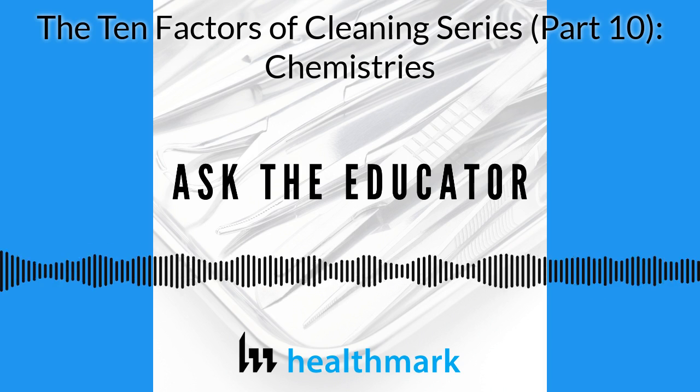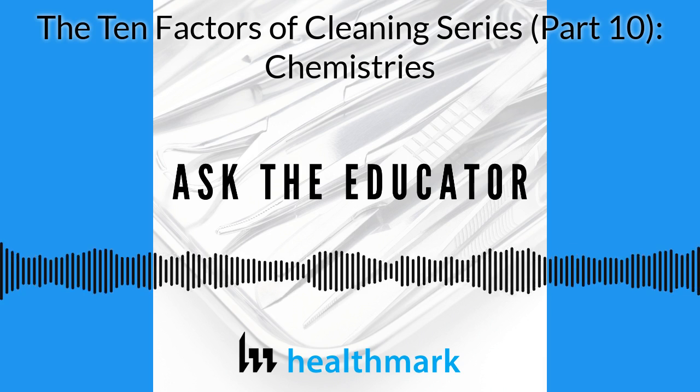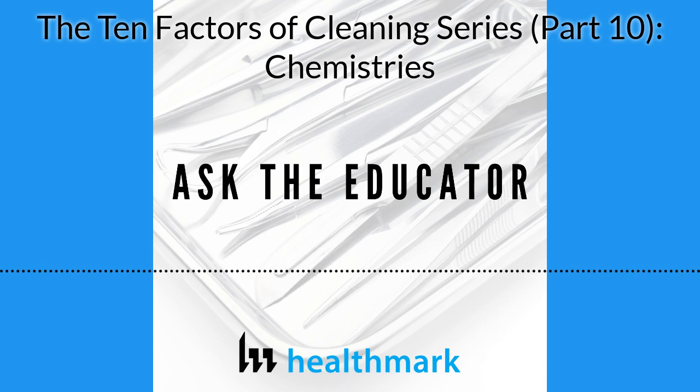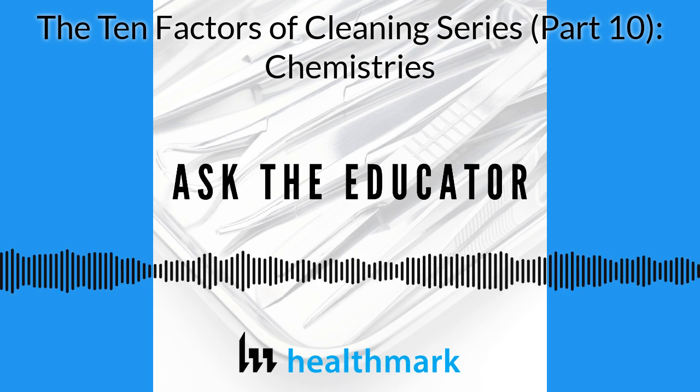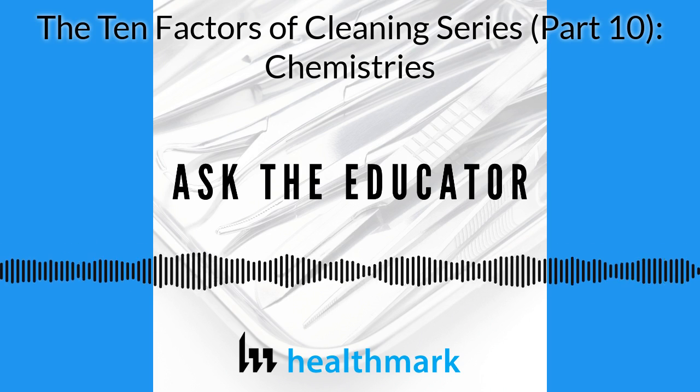But even with that, there are a lot of terms. For us in sterile processing or medical device reprocessing, we do want the cleaning solutions biodegradable, but I break them down into three.